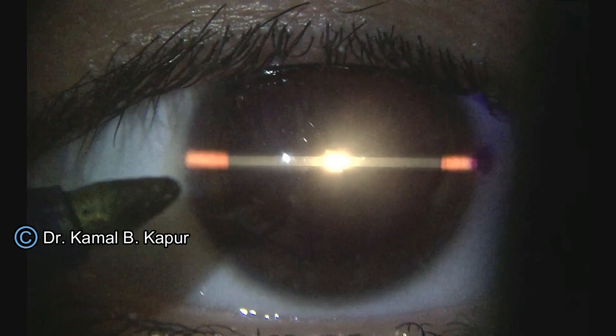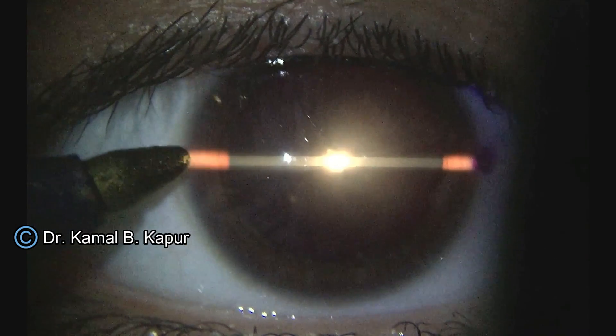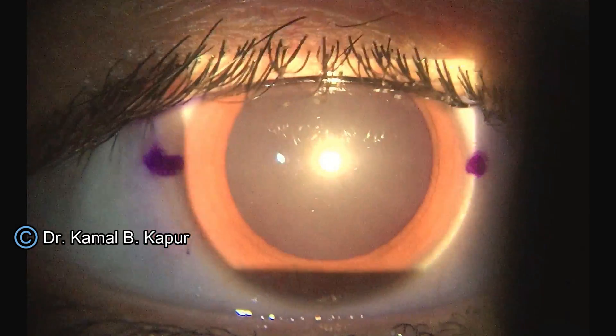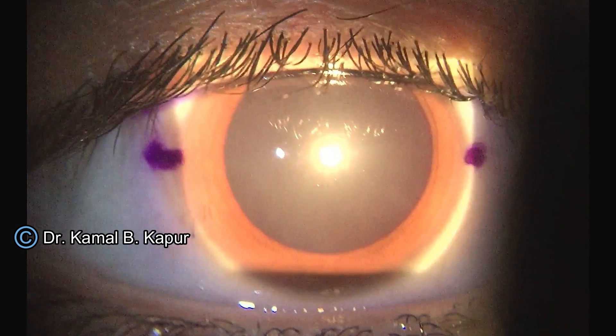Mark the second point at 0-180 degrees. This now forms your primary axis, or primary 0-180, which can be used as a reference to mark secondary angles in the operation theater to align the toric lens.